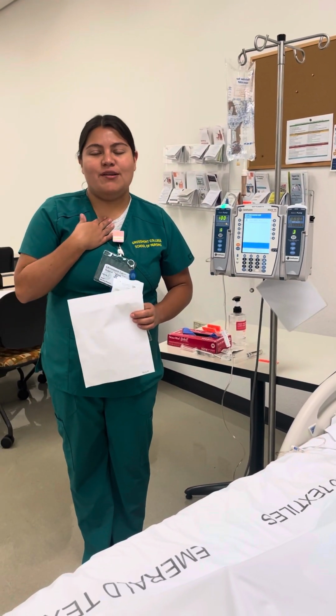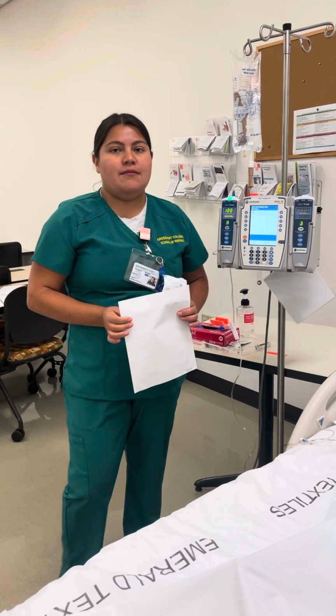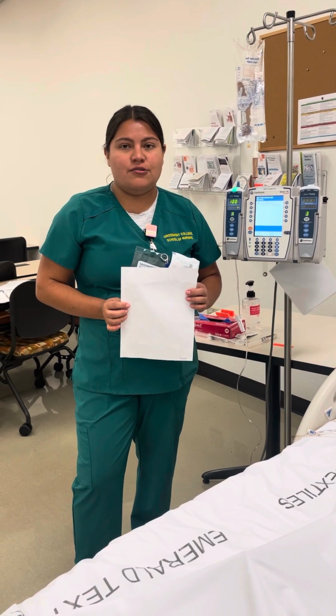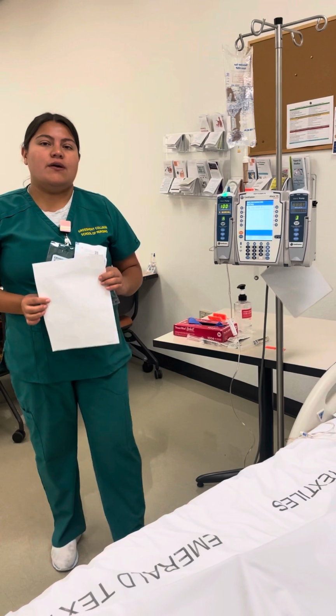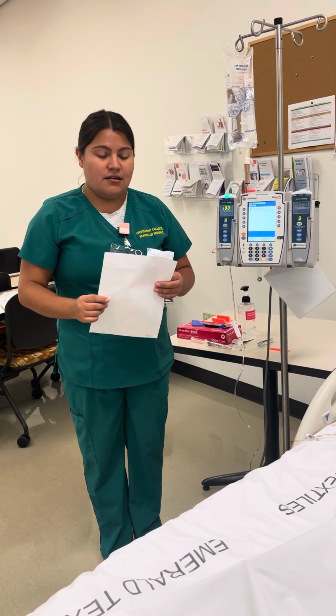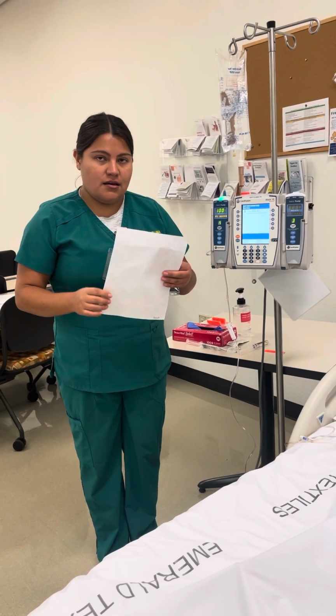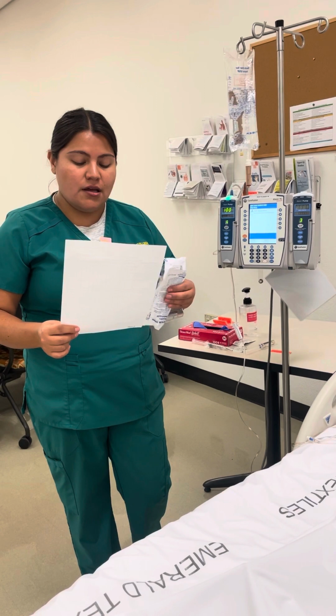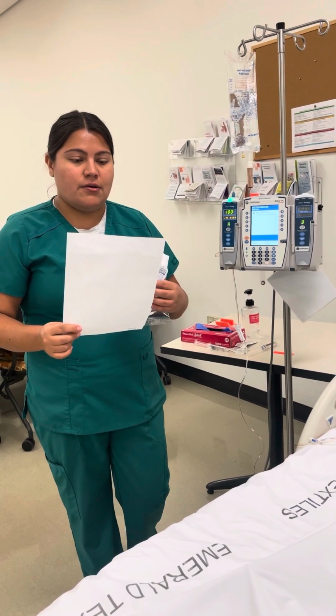My name is Paola Mendoza, and I will do IVPB for my class Nurs 130. Before I enter into the patient's room, I already did my first and second check on the MAR, where I check the patient medication. He has an order for cefazolin, 2,000 milligrams in 100 ml.